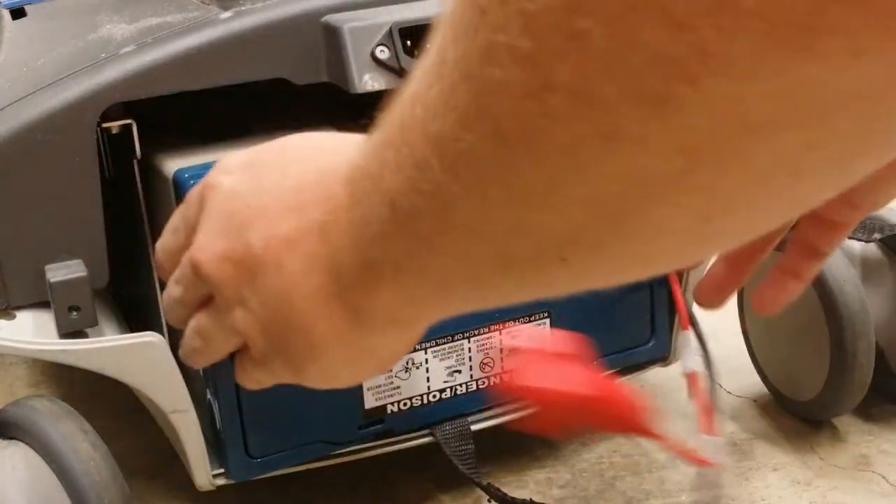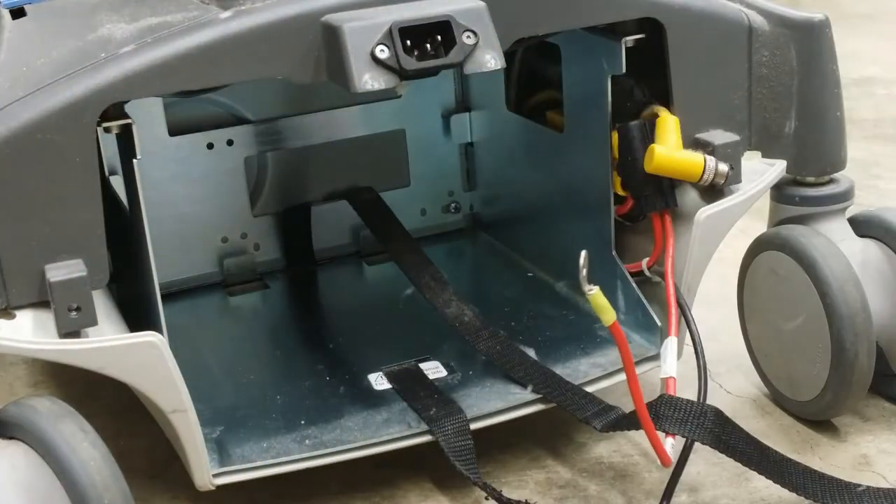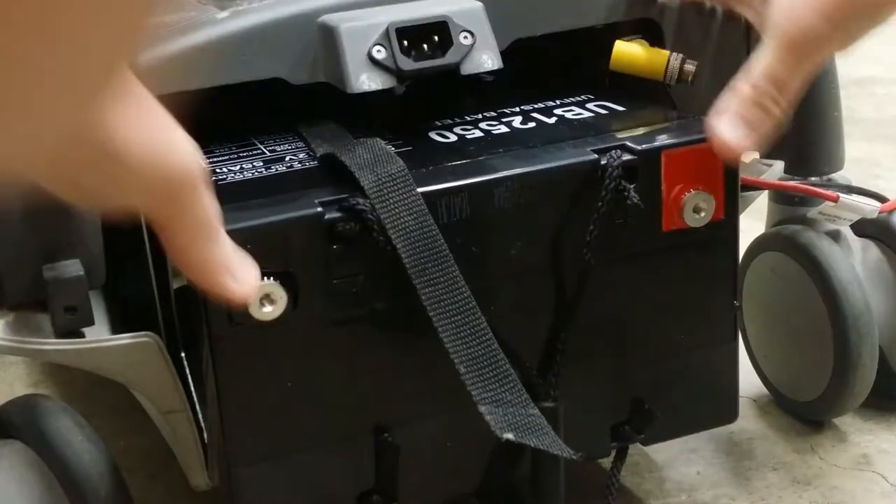Slide out the old battery. Slide in the new battery and strap it in.